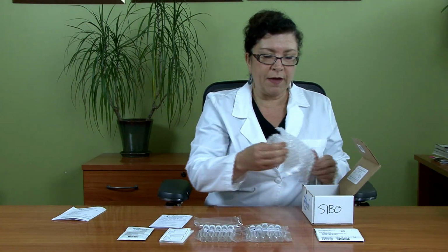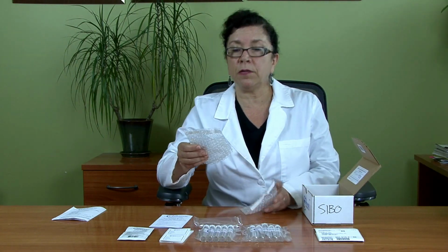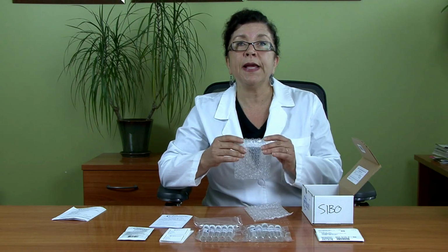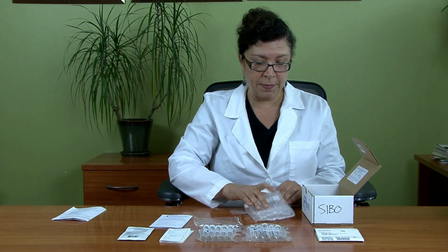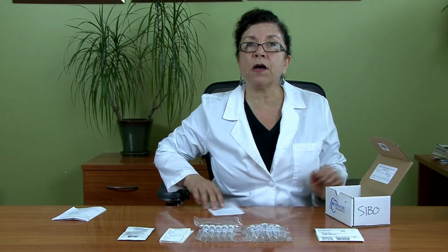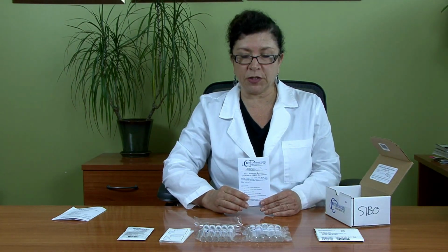And then of course we have a couple of sample bubble wrap holders. So when you're through, you're going to put these glass tubes in these bubble wrap holders when you're ready to mail it out. So the first thing I'd like to talk about is what is on the test kit instruction.